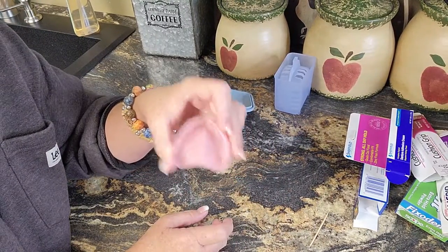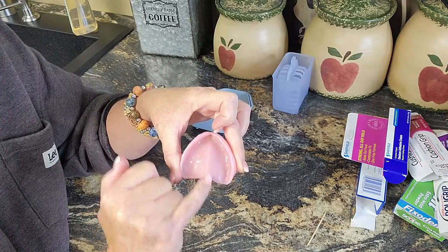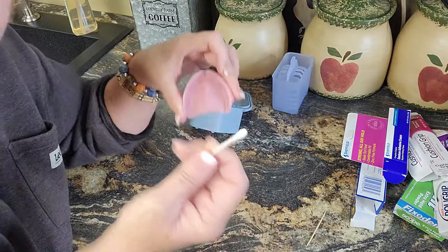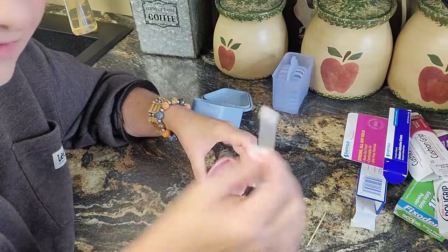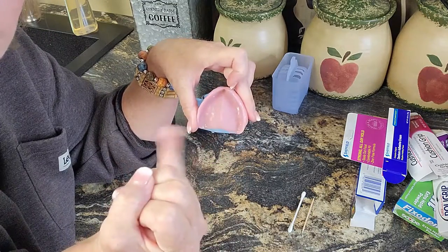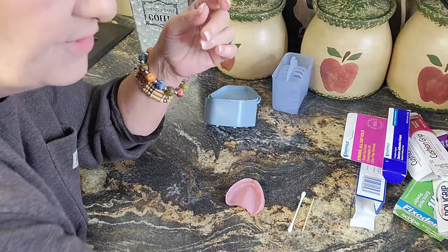Here is my top denture. We're not going to put adhesive on the bottom yet because you probably still have sore spots. We're going to put it right down the center. When I was a little girl, I used to watch my grandmother — she always did it with a wet Q-tip. My grandmother was applying denture adhesive with a wet Q-tip or sometimes a toothpick. Either or — or just use your finger.